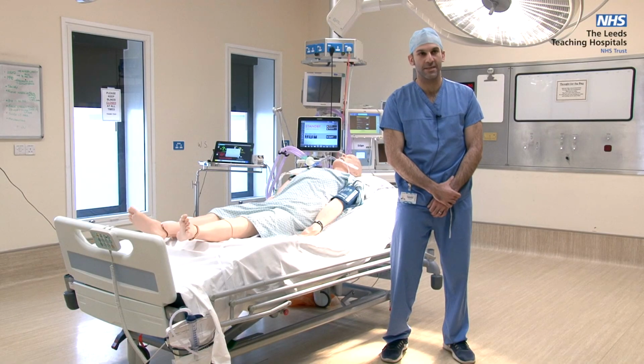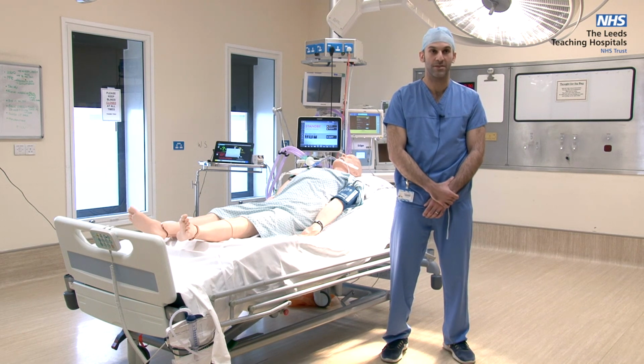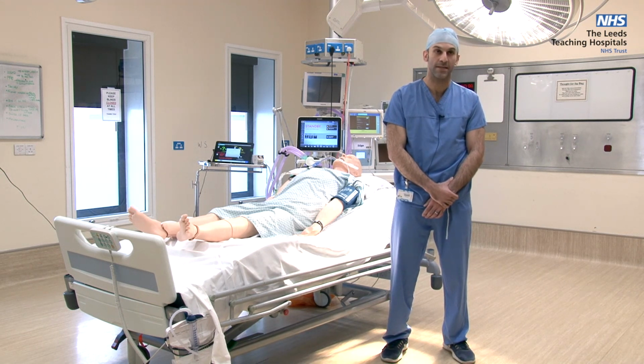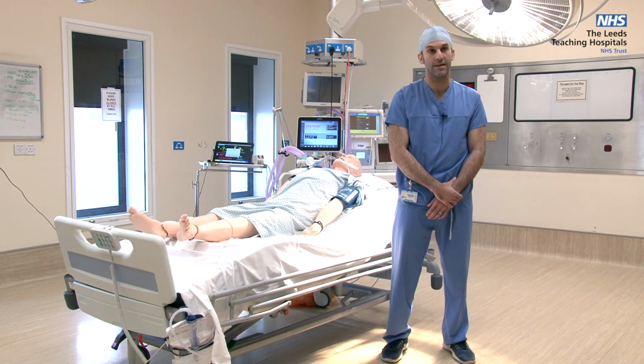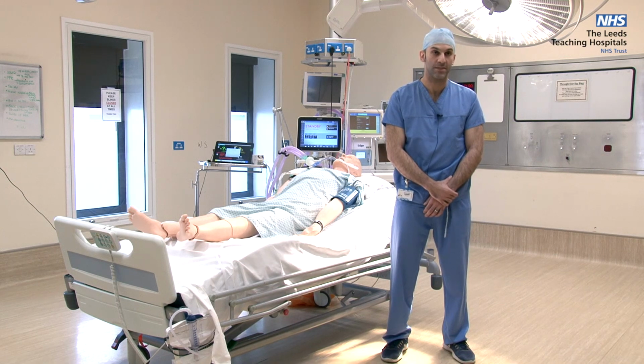I cannot emphasise enough to you the importance of maintaining your own safety during this procedure. Intubation is one of the most aerosol generating procedures that any anaesthetist or intensivist will be involved in regularly. It's for this reason that we are very keen to emphasise the importance of adequate training in PPE and donning and doffing of your personal protective equipment.